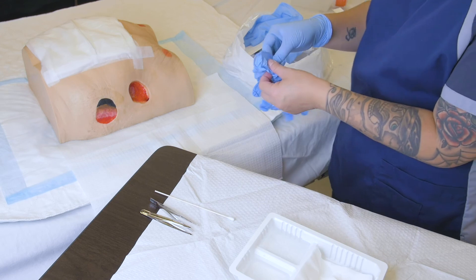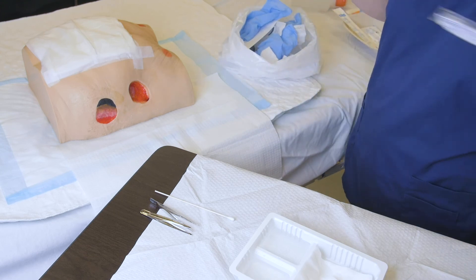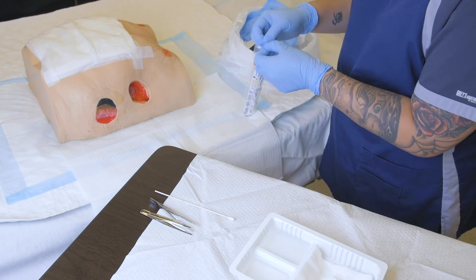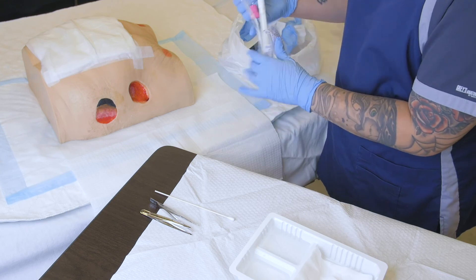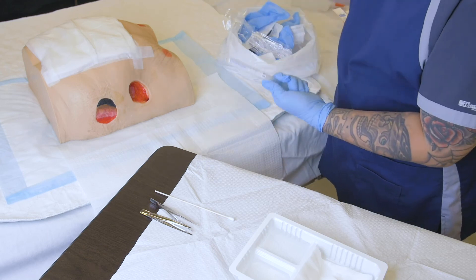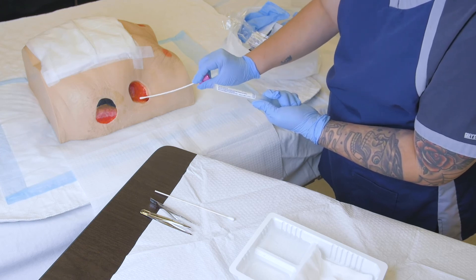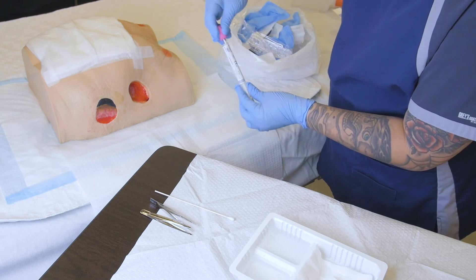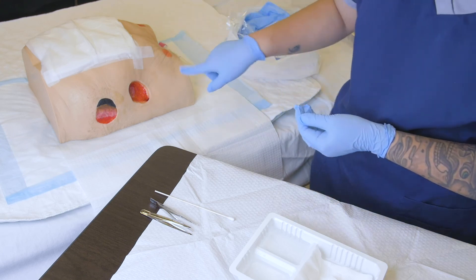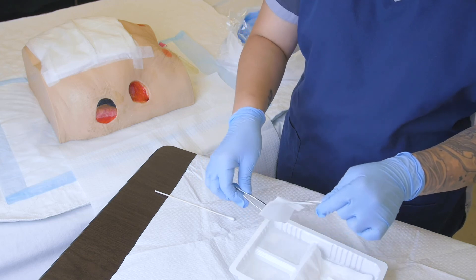Now that we've assessed the wound, we're going to collect a C&S swab if it's necessary — this is just an example of when it would be the right time. We apply gentle pressure so we can collect a little bit of moisture, and we want to collect this swab from viable tissue. We can label that later on and send it to the lab for assessment.